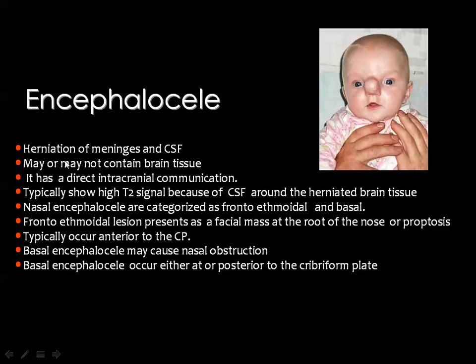This encephalocele may or may not contain brain tissue, and it is usually communicated directly to the intracranial space, and the contents may show high signal because of the CSF as well as some of the herniated brain tissue, which may be disorganized brain tissue.